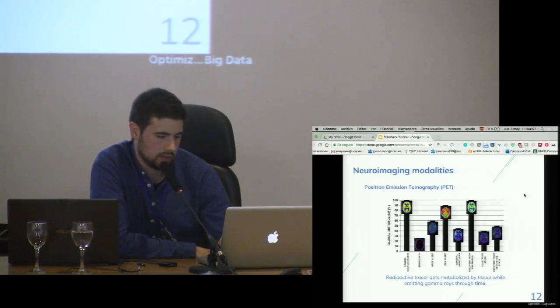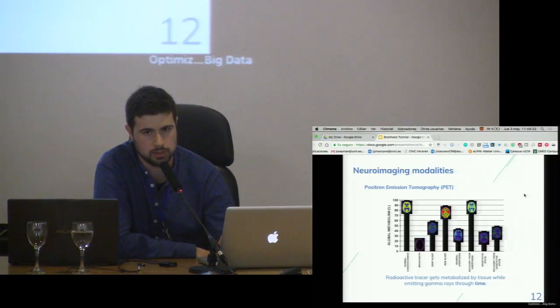So for anesthesia, after recovering from anesthesia, vegetative state, you can see curiously that when you are in rapid eye movement sleep, the brain is getting more energy than in other cases. You can also see that brain death is completely black, and that's because when somebody enters brain death, this is not something like a vegetative state. Brain death is dead, and there is not a single case in the whole history of someone who has recovered from brain death, because basically you have lost the structural integrity of your brain.